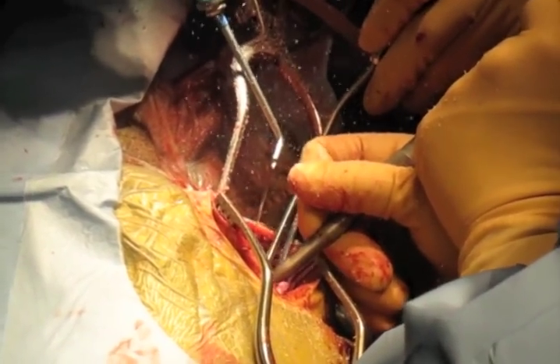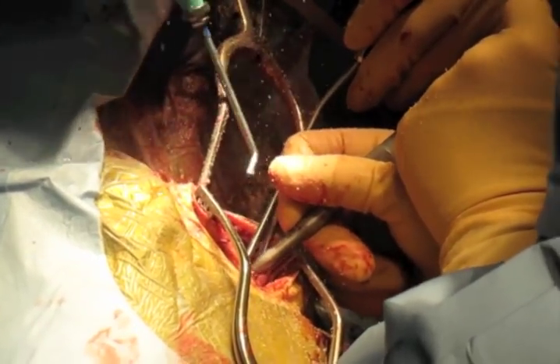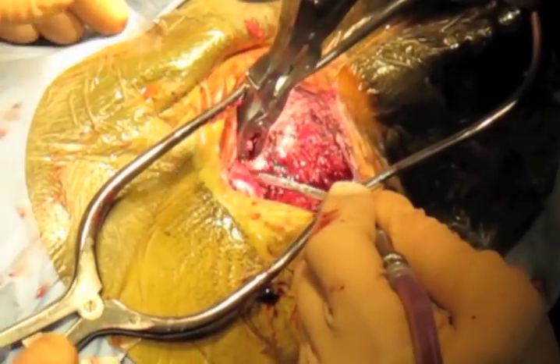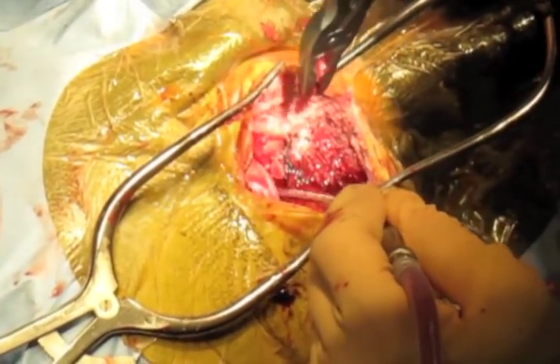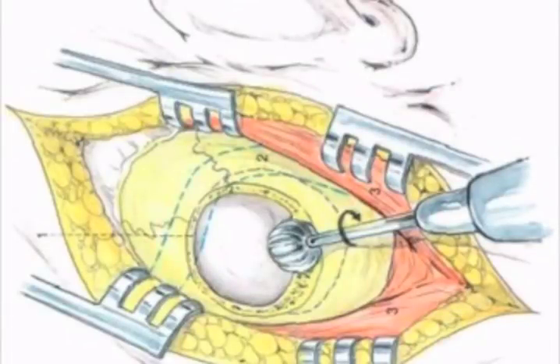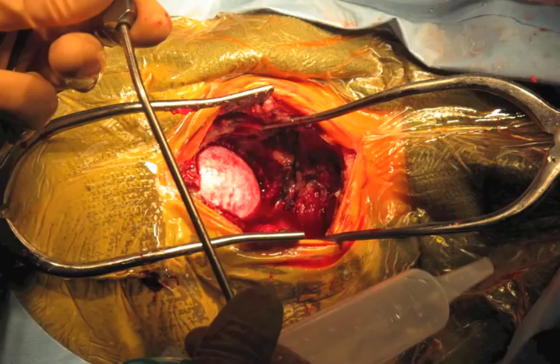At this time, a craniectomy is performed using a combination of high-speed drill and Rongeur instruments, taking care to leave the dura intact. The craniectomy is extended with the transverse and sigmoid sinuses providing the superior and lateral limits respectively. The medial and inferior limits depend on the case and amount of exposure necessary.